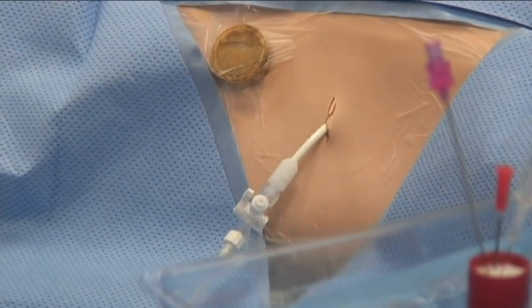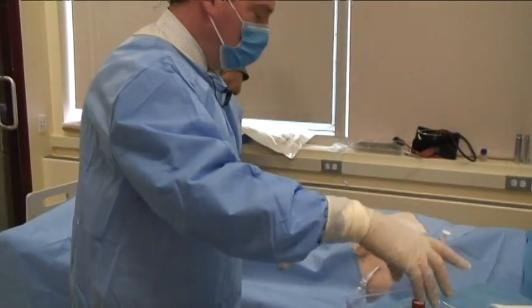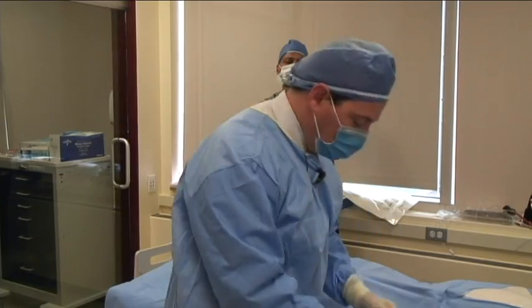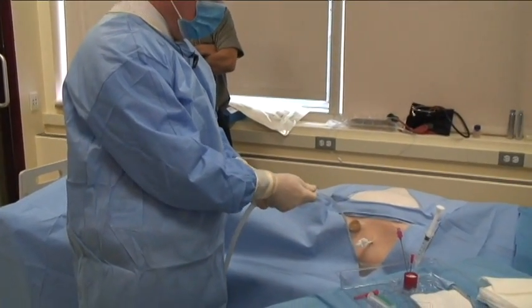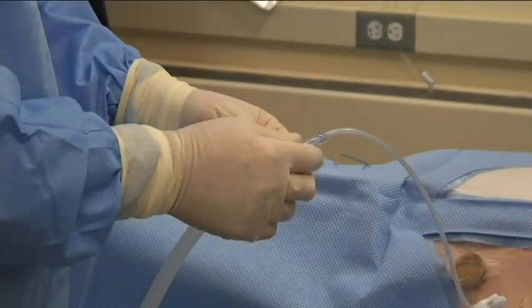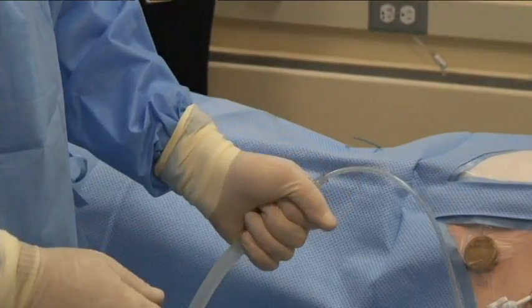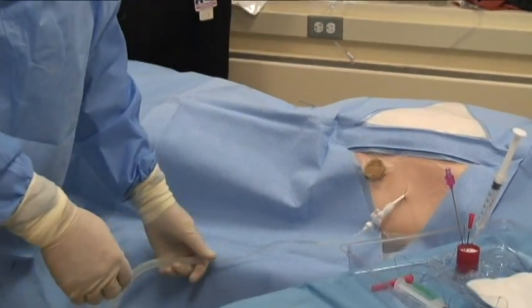And at this point, our procedure is done. Making sure all the sharps are taken care of and put away properly. And again, making sure all your connections are secure. We often need to put a little extra tape around these connections just to secure them, because this, you can see, may come off rather easily. So sometimes I'll wrap a little bit of tape around here just to make sure that's a secure connection. And just make sure that there's not a lot of pull from the device.